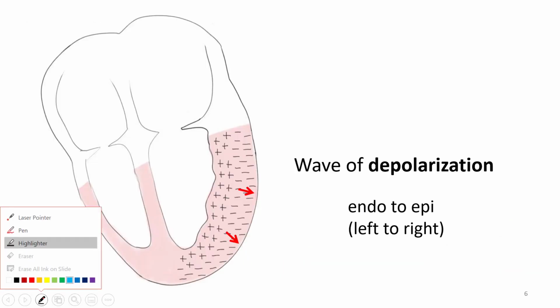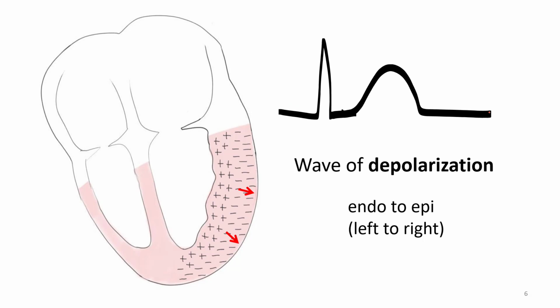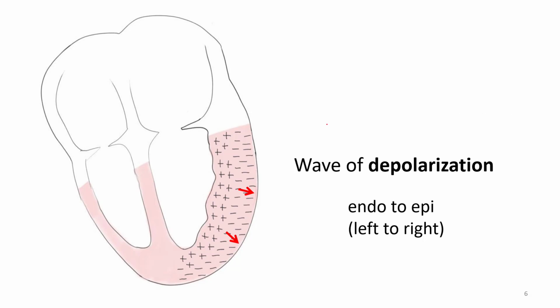One question that sometimes comes up is why the QRS and the T wave are both positive, or in some leads both negative. How come they're not in opposite directions, since one represents depolarization and one repolarization? It's a good question. It's a little hard to explain, but something like this.